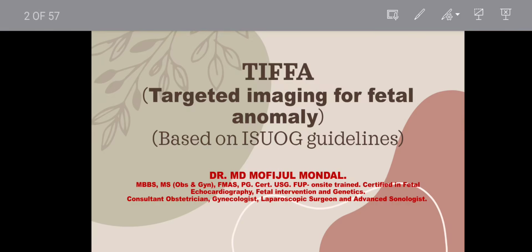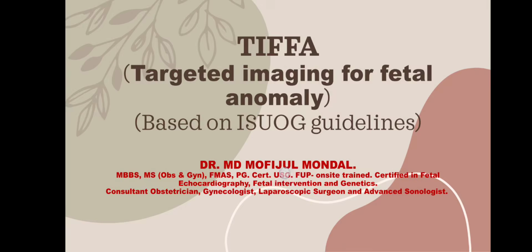These are globally accepted guidelines. This presentation is primarily based on the current ISUOG recommendations, together with practical experience accumulated during routine fetal anomaly scanning.